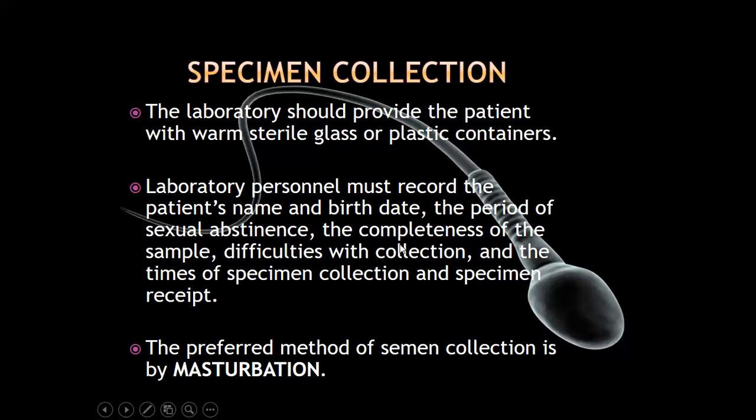Any difficulties with collection. The usual difficulty of collection here is that for some patients it will be difficult for them to ejaculate. So for example, patients who have difficulty with collection. And we need also to note the time of specimen collection.